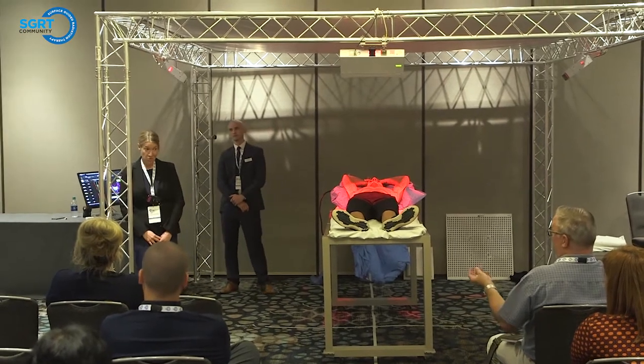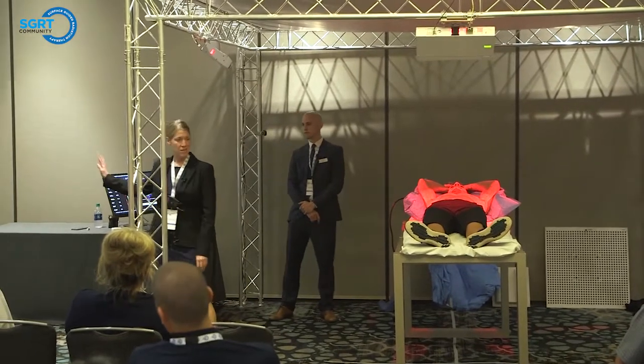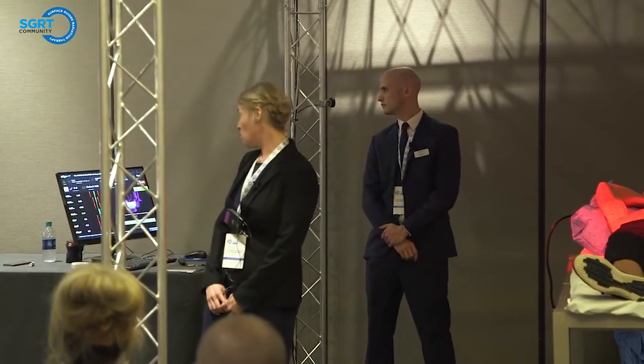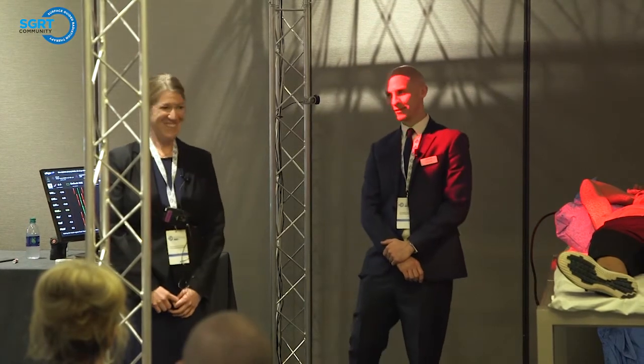And yes, your directions are based on your IEC scale. So whatever scale that you have, those are your positions. So if your roll is on the right of that screen, you would roll on that patient's side. That's what I see, yeah. Shortcuts for the lateral setting and which way to go? Yeah, we were just talking about that.